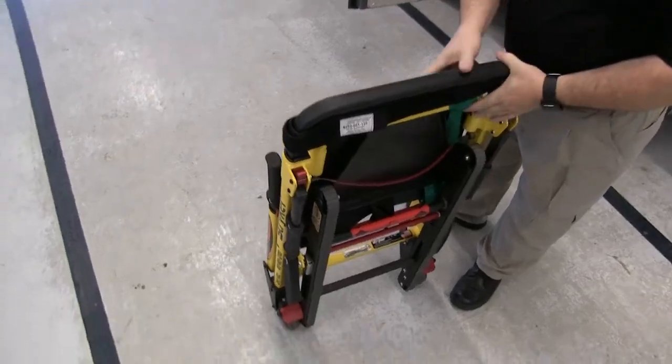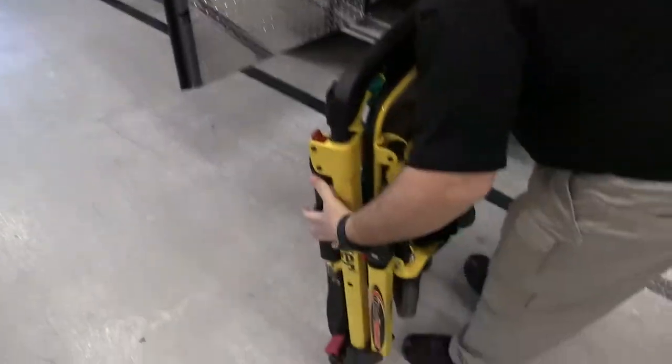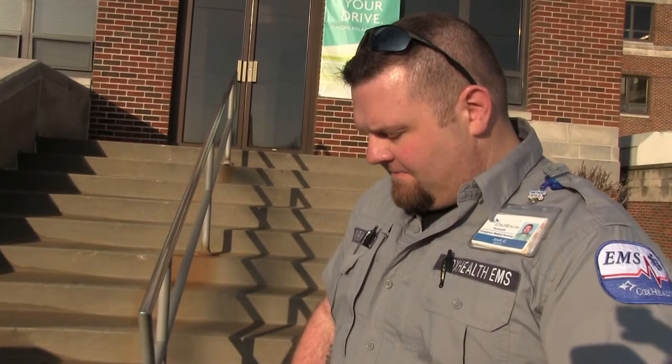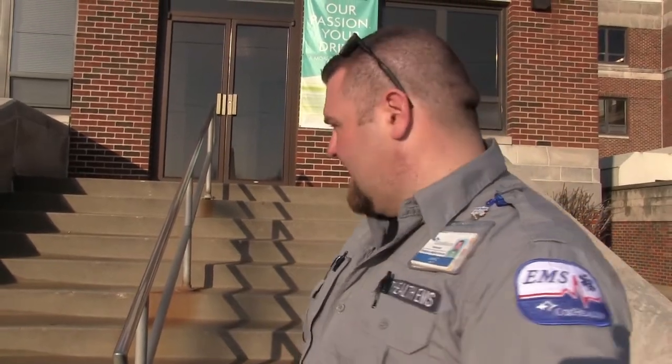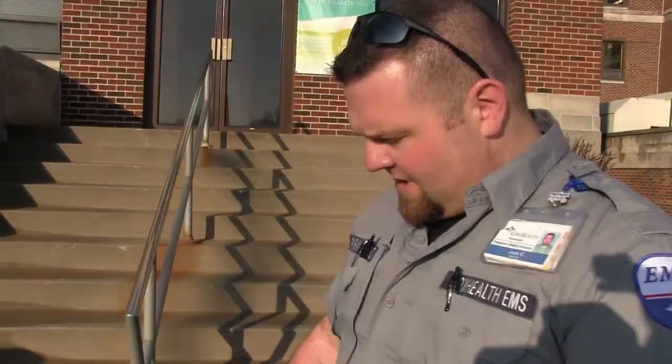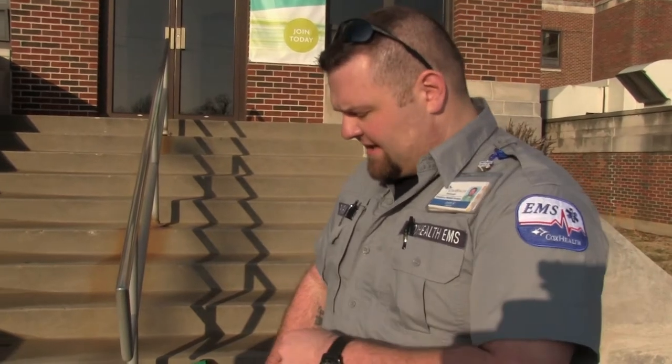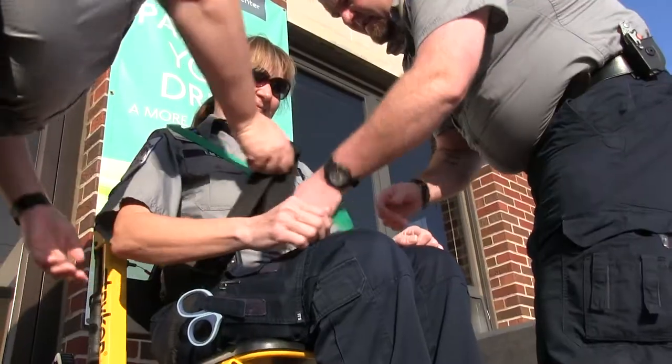A little cable pull lowers that, and it's ready to go back on the truck. A couple of the benefits of the stair chair are that you can use it to move a person in or out of a house, go up and down stairs of course, and use it in situations where it may not be advantageous to use the cot. You could take the cot up those stairs, but it wouldn't necessarily be the safest thing to do. One of my favorite times to use it is in the back room of a house — tight quarters, like going into a trailer where you just really don't have room to get a cot back to your patient. You take this, put your patient on it, and just wheel them out.